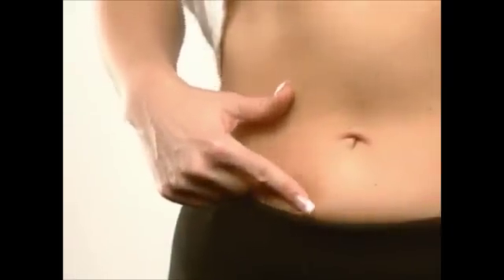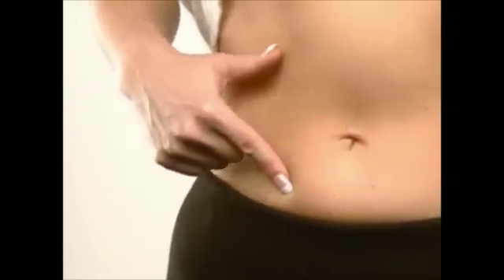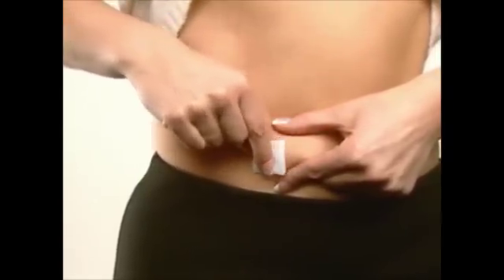Choose an injection site in the lower abdominal area, preferably around the belly button, but at least one inch away. Take an alcohol wipe and clean the skin at the injection site and allow it to air dry.